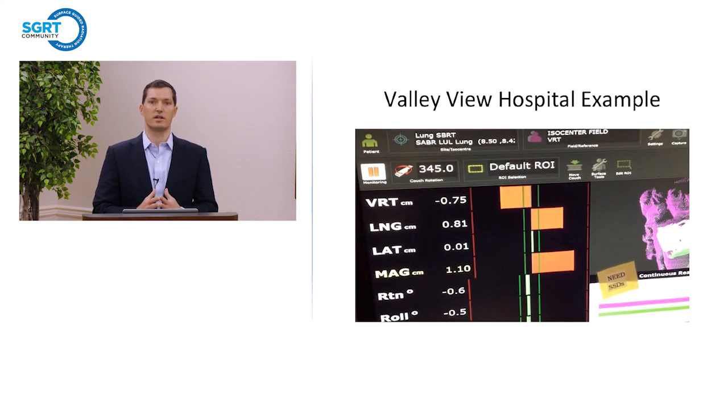As you can see from that video, using AlignRT gives us the ability to accurately monitor the patient's surface anatomy to make sure that during the course of the radiation treatment for SBRT that the breath hold is accurately reproduced.